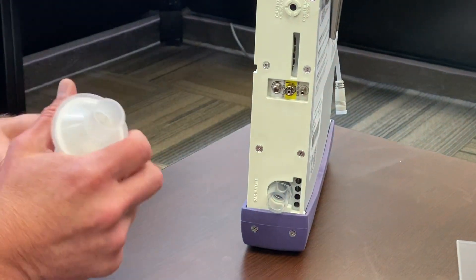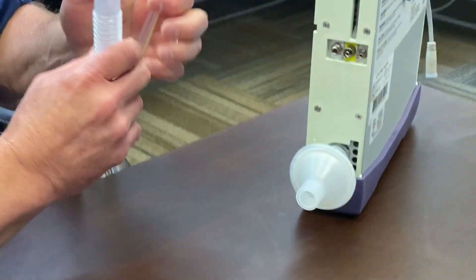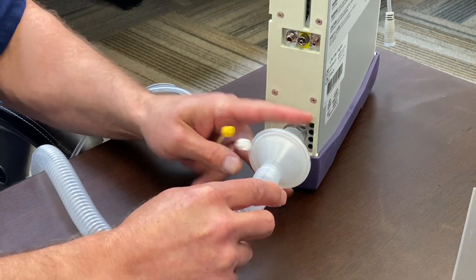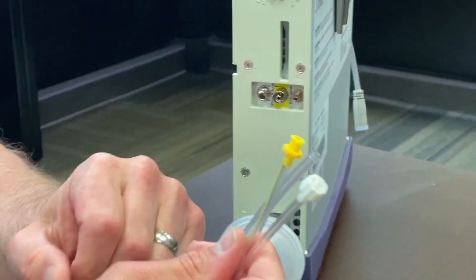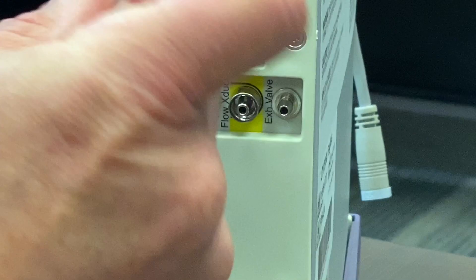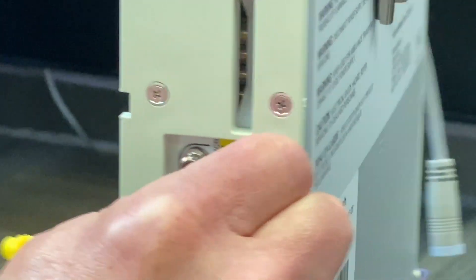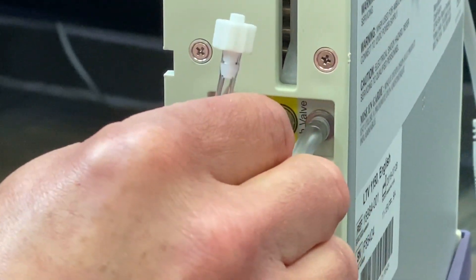You will attach your bacteria filter and then attach your circuit. You'll see that there are three lines associated with the LTV circuits. You cannot hook them up wrong — each one has a distinct plug-in. The first one is the proximal pressure line; the next one is the flow transducer, which is yellow color-coded.